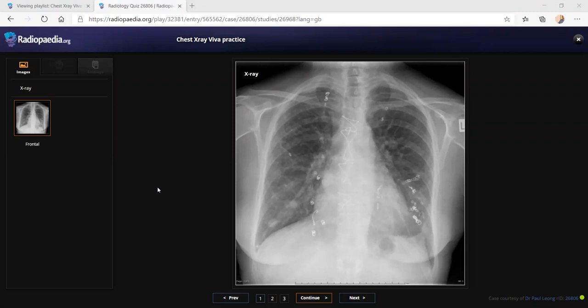What's your primary inference and diagnosis before going to the CT? Why the patient needs a CT? Because patient is currently not symptomatic. Now it just came for follow-up in a chest OP. Okay. So why you need a CT scan? So since these lesions look suspicious for primary, maybe possibly metastatic deposits, that's the only thing.